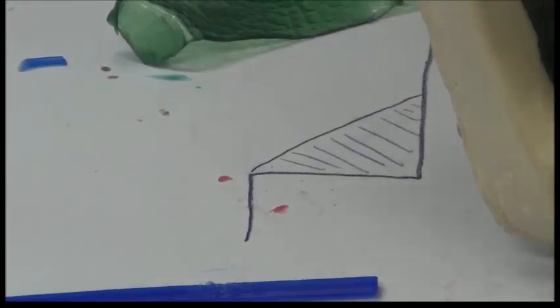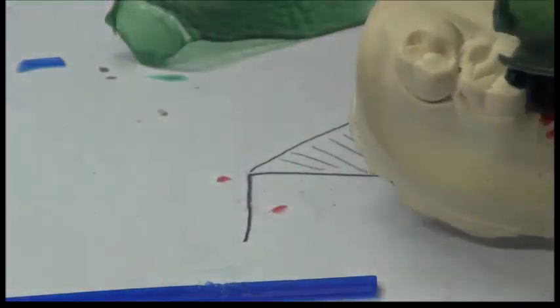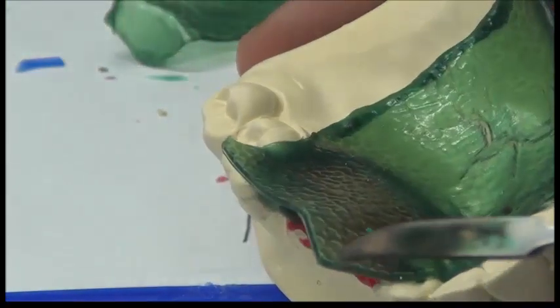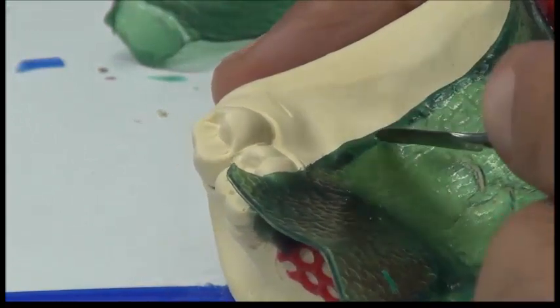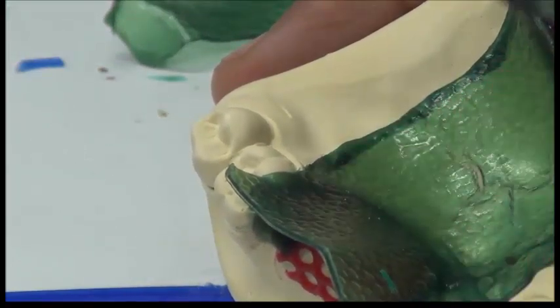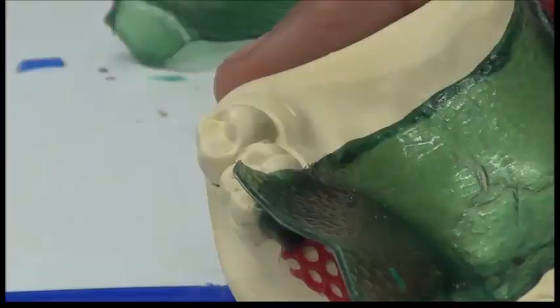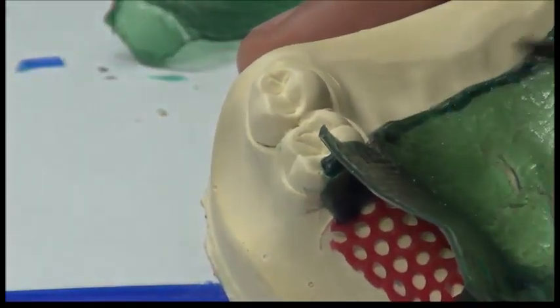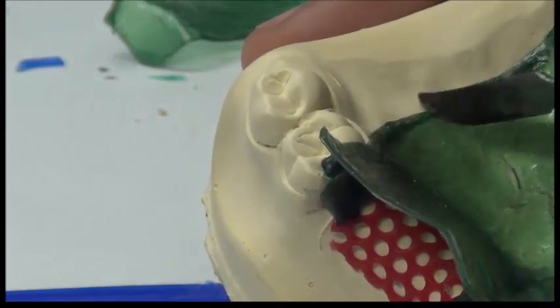And I'm reaching the second abutment. Okay? So when I separate these, now you can clearly see the beading line is beneath the major connector. Okay? I don't cut anterior to it, I cut posterior to it. So now they are included together, and I could bevel them slightly.